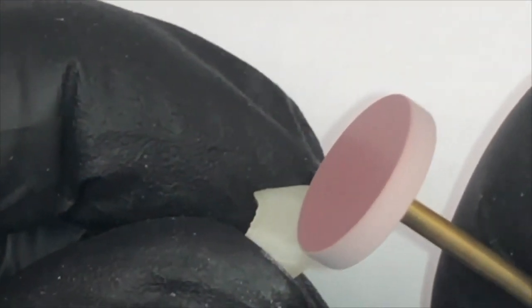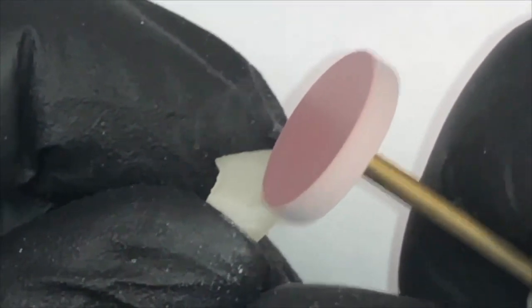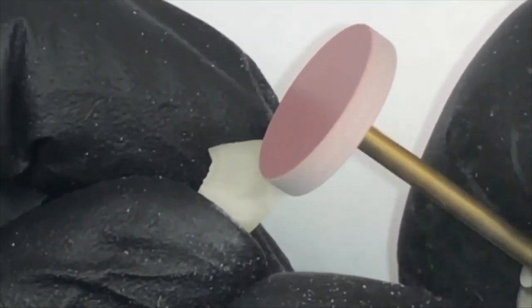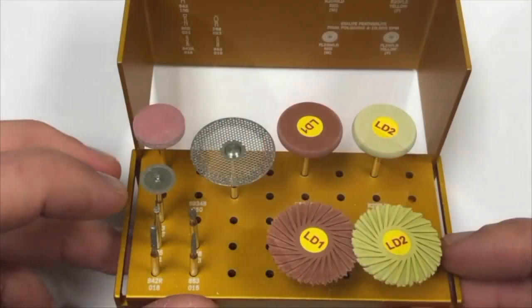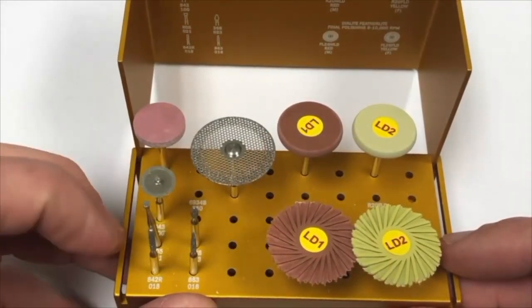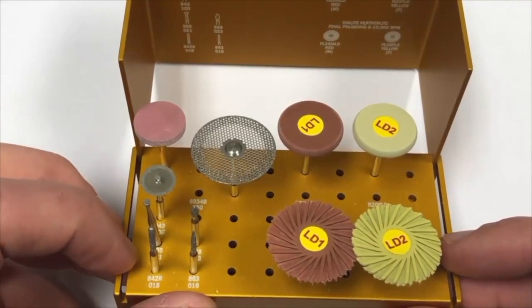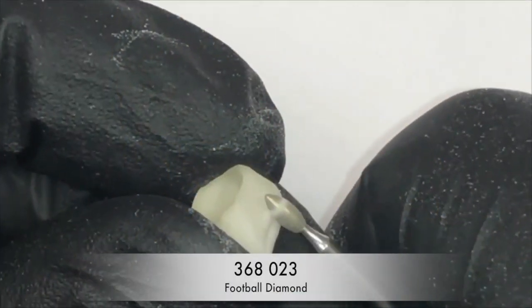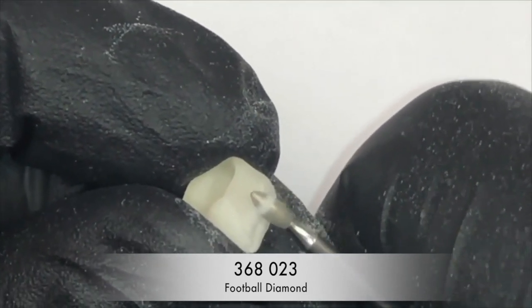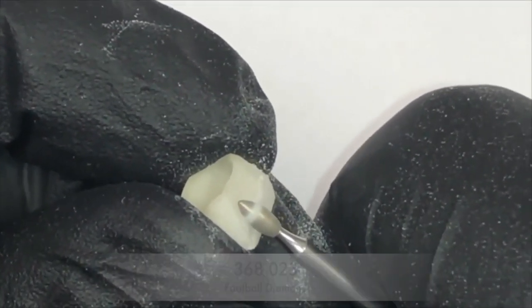It is also very effective to sharpen the lingual aspect of the incisal edge on anterior restorations. The 368023 diamond is very effective at both reshaping occlusal anatomy on posterior restorations and the lingual surface of anterior restorations. Here you can see this diamond reshaping and sharpening the lingual surface of an anterior restoration.